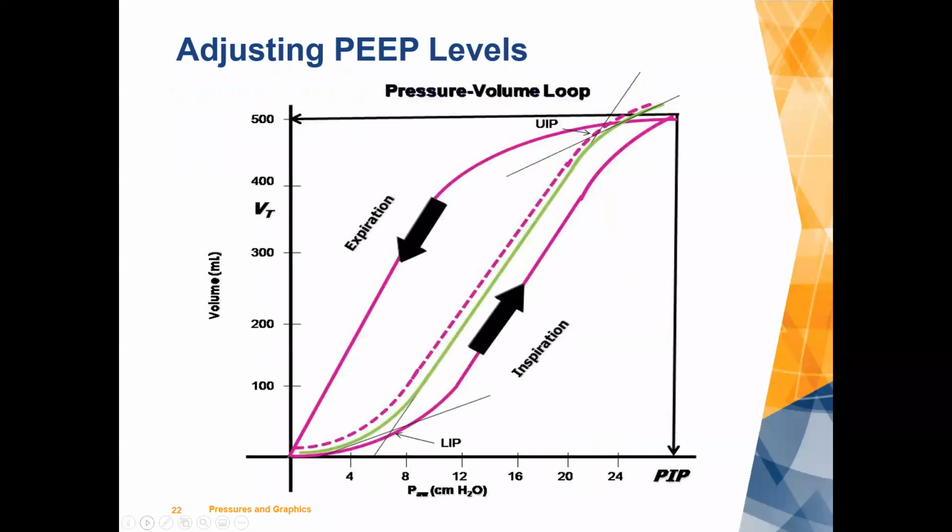In some of those patients, when you pull up a pressure volume curve, you can actually see at the top portion of the curve what looks like, crudely, a bird's beak. It's suggestive that you're over-distending the patient's lungs: you're getting an increase in your PIP, your pressure, but when the top of that beak is horizontal, you're not getting any increase in volume. You're just increasing pressure.